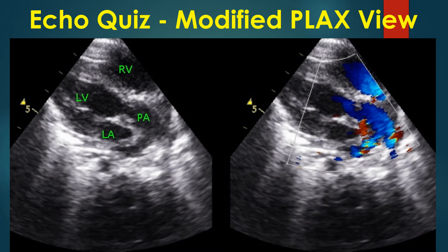The great vessel can be clearly seen as bifurcating into two branches. This appearance is characteristic of the pulmonary artery. When the aorta is imaged distally, the arch with great vessels will be seen.